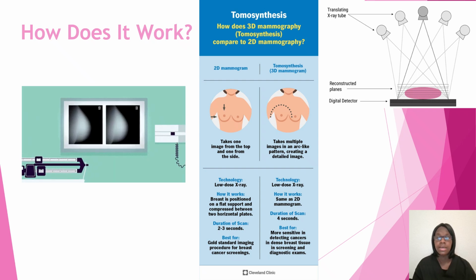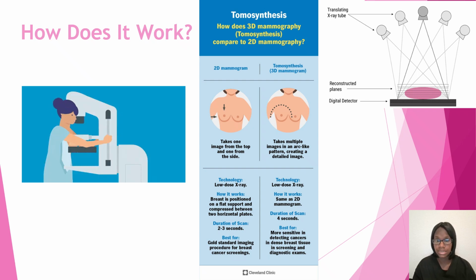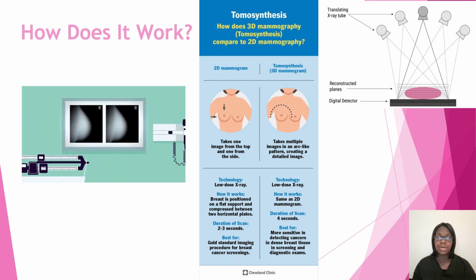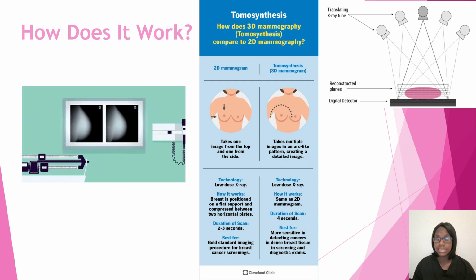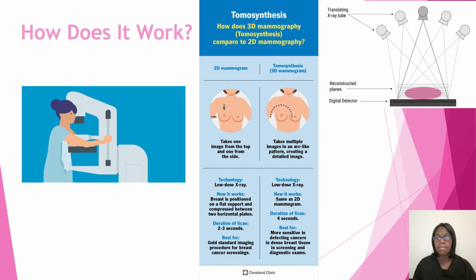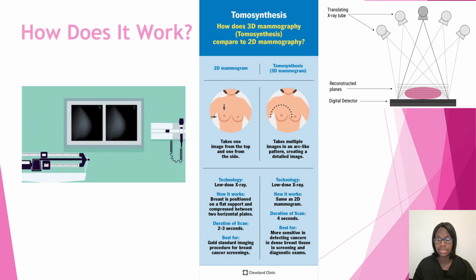Now for the 3D, the tomosynthesis, this is going to take multiple images in an arc-like pattern. This is going to create more detailed images. It is still low dose, but it also gives more radiation to the patient. I will explain how later on in the video. It does take a little bit longer to complete every picture. When you take the first half, it'll probably be about 4 to 5 seconds. But the patient has to relax in between, breathe out, and then hold their breath again because the image is going to be taken again.